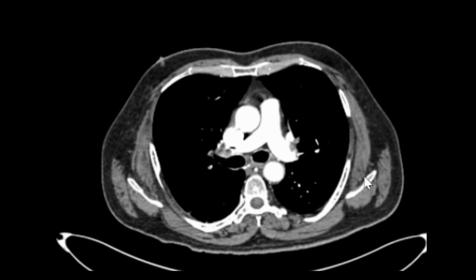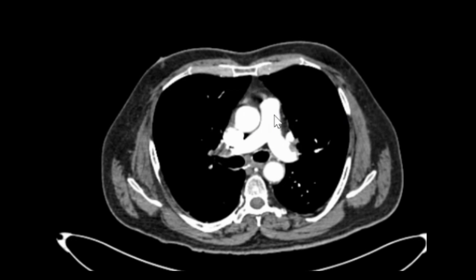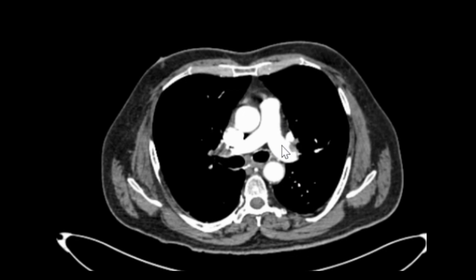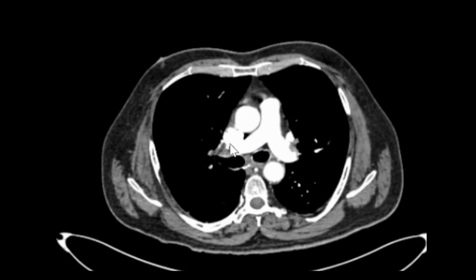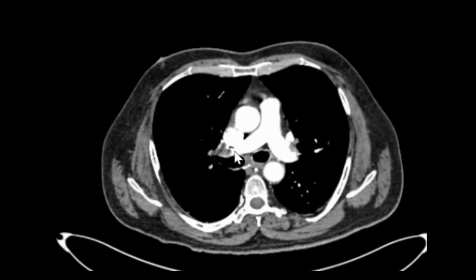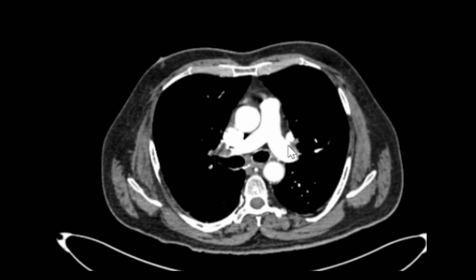Now we can clearly see the pulmonary trunk — the main pulmonary artery — with the right and left pulmonary arteries. Vessels are well filled with contrast, but here we can see an irregular-shaped filling defect in the right pulmonary artery.